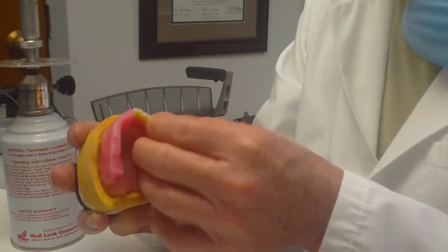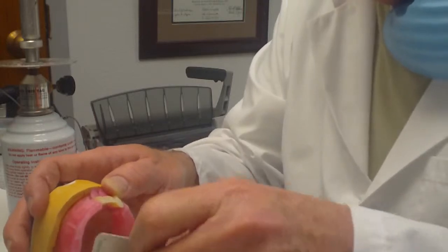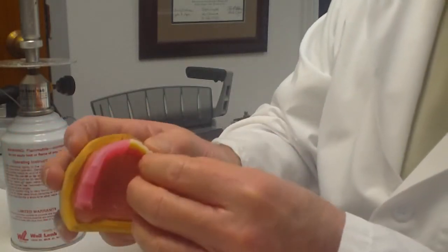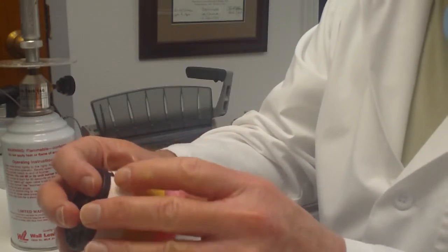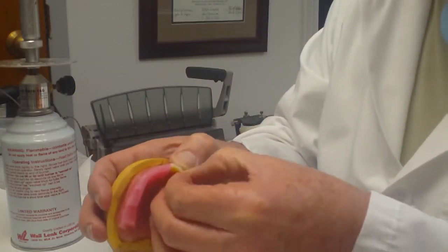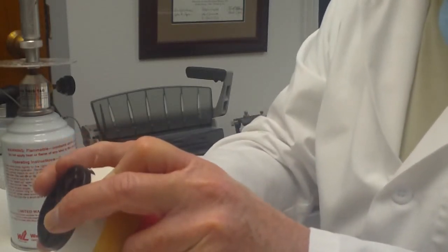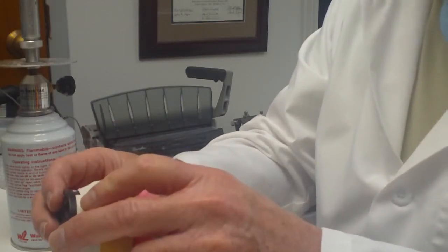So I'm doing the same process as I did before, using the little tail to help position the tooth. We want the incisal edge, or the tip of the canine, to be in the same occlusal plane as the central incisor, and I'm going to take a look at it from the anterior myself, and maybe the lateral needs to be rotated just a little bit. It looks like it's not really in the axis that we'd want it in, so I'm going to rotate it a little bit, and again take a look at it from my point of view and see if that tooth position is reasonable.